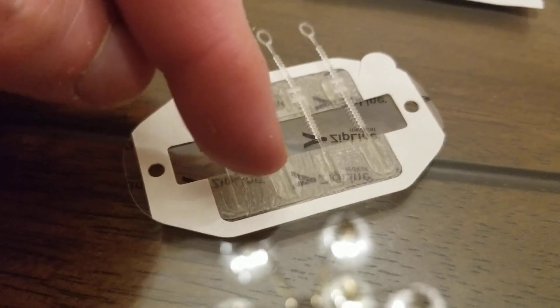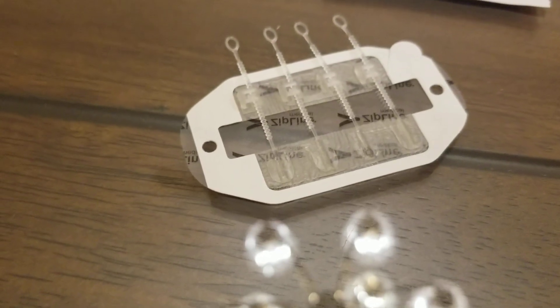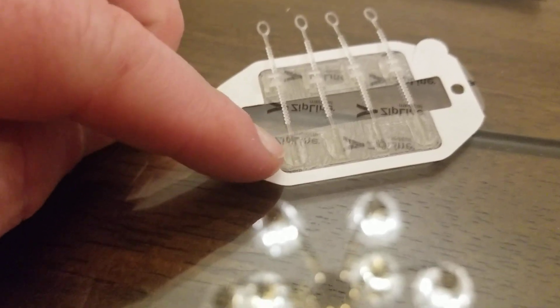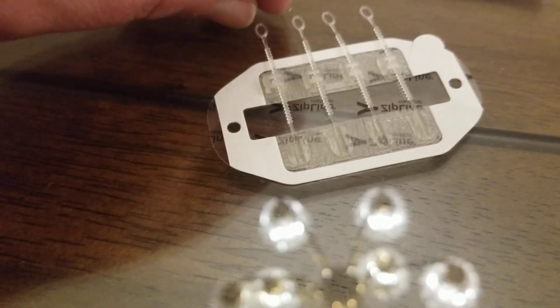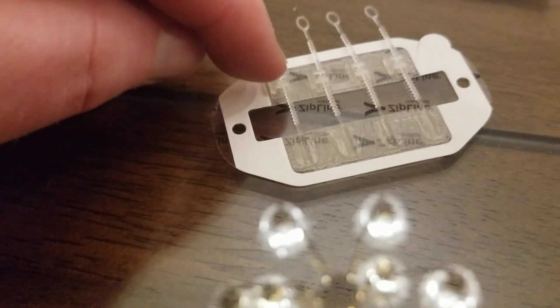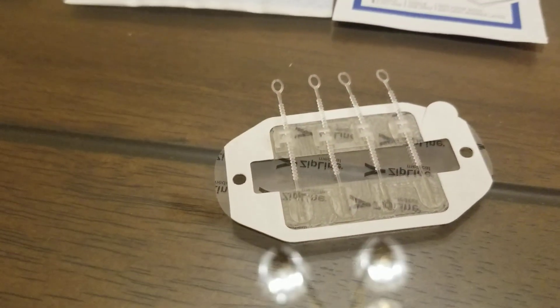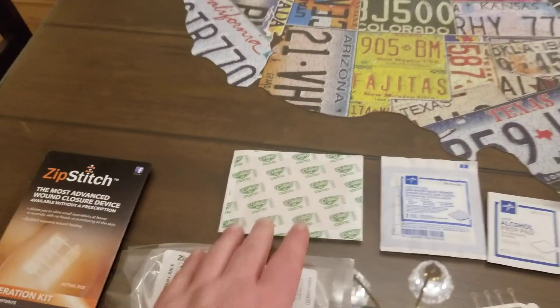You've got these little plastic pieces stuck down into really sticky adhesive on one side, and the same on the other side. Then you have a little zip tie mechanism on the top. You just pull this little end — it works like a ratcheting zip tie. When you pull it, it locks into the little grooves and makes it tight. Once you've got it snug — not over-tight — and the wound is closed up, they provide you with a bandage to put over the top of it.